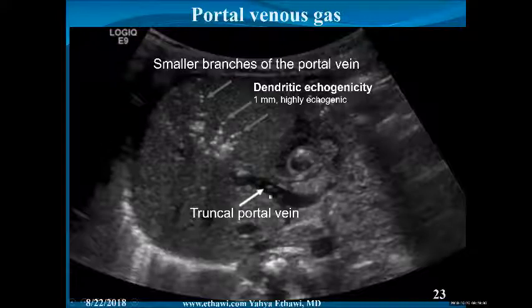Correct, because like let's assume this is air, but you think it might be biliary system, or it might be a hollow organ, or it might be a bowel. So if you put a Doppler on it, you'll see color change. So you know this is vessels, all right? Normally, you don't see turbulence of the flow in portal because the flow is very laminar, because there is no active pump inside the liver. So when it becomes not laminar and it becomes turbulent, then there is something inside it causes the turbulence.